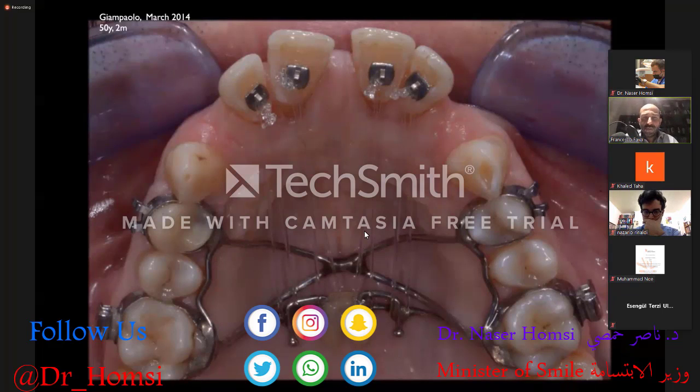The connection of the teeth is very stiff because we have 3 transpalatal bars, one connecting the molars and a cross-welded bar connecting the premolars with the molars, with the shape of a cross. All the bars are soldered together in order to obtain a very high rigidity.